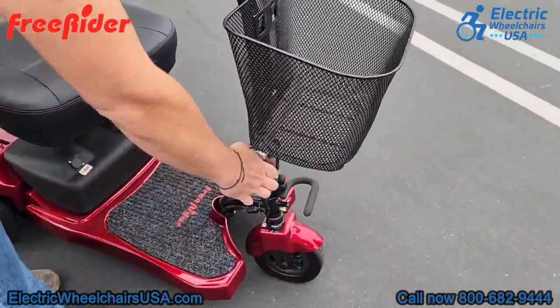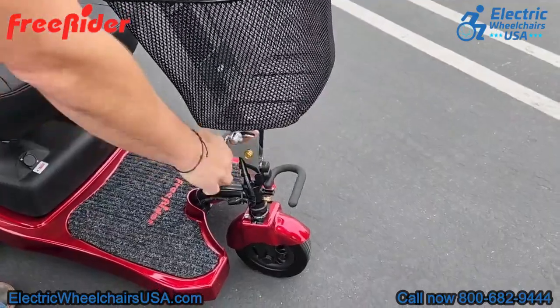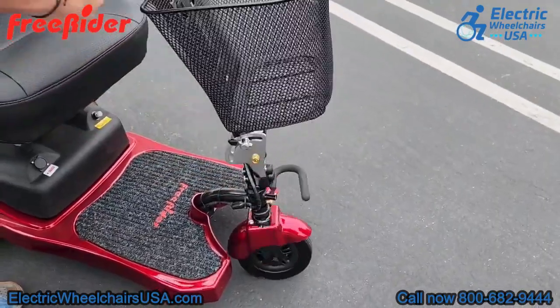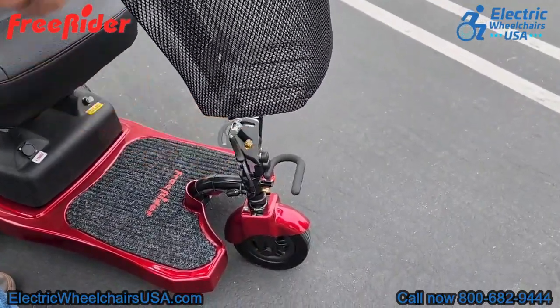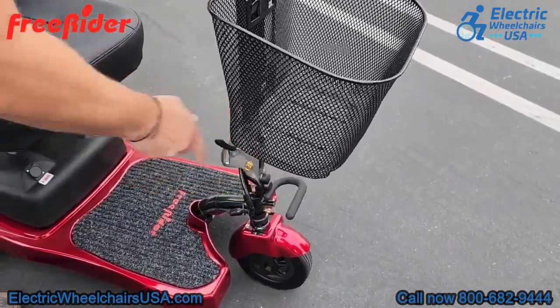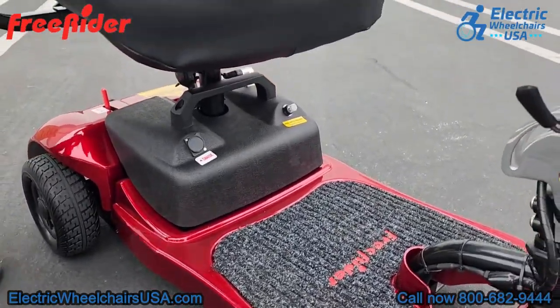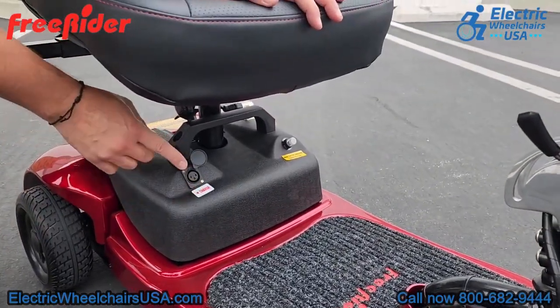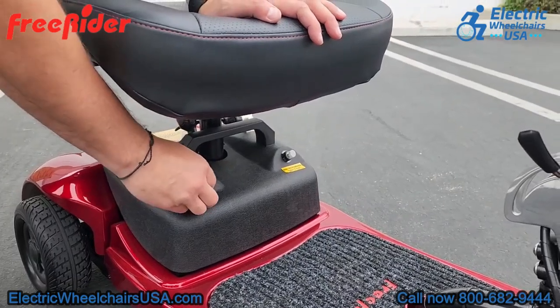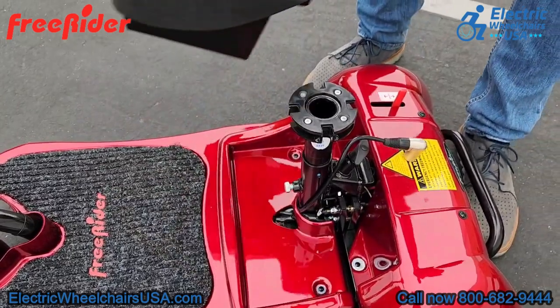There's also a large front basket to store your belongings. There's a knob that will adjust your tiller — you loosen it and lock it back into place — so if you're taller or have longer arms you can adjust it toward or away from you for a comfortable driving position. The battery pack is located right under the seat, and you can charge the batteries directly on the battery pack while it's on the scooter.